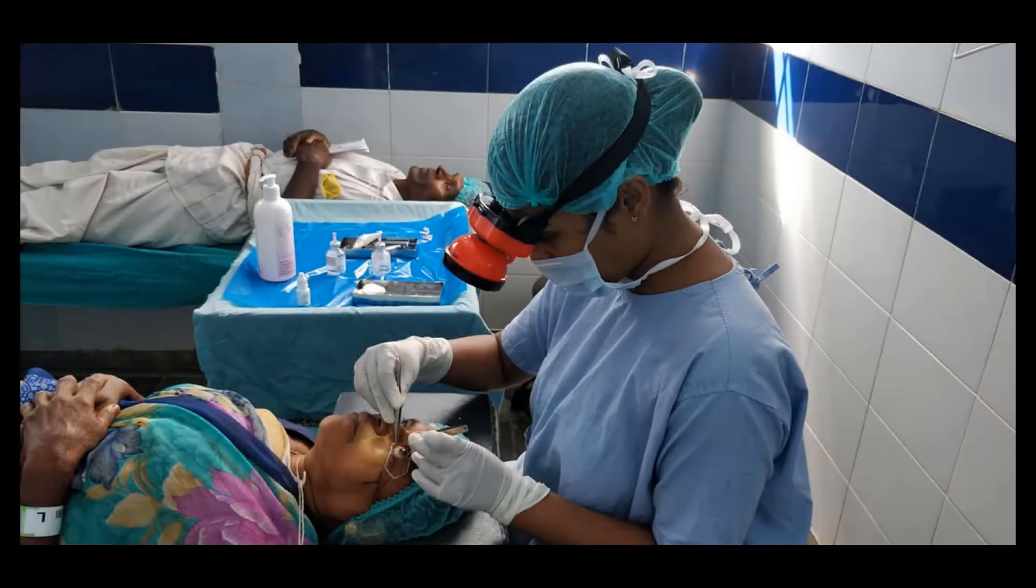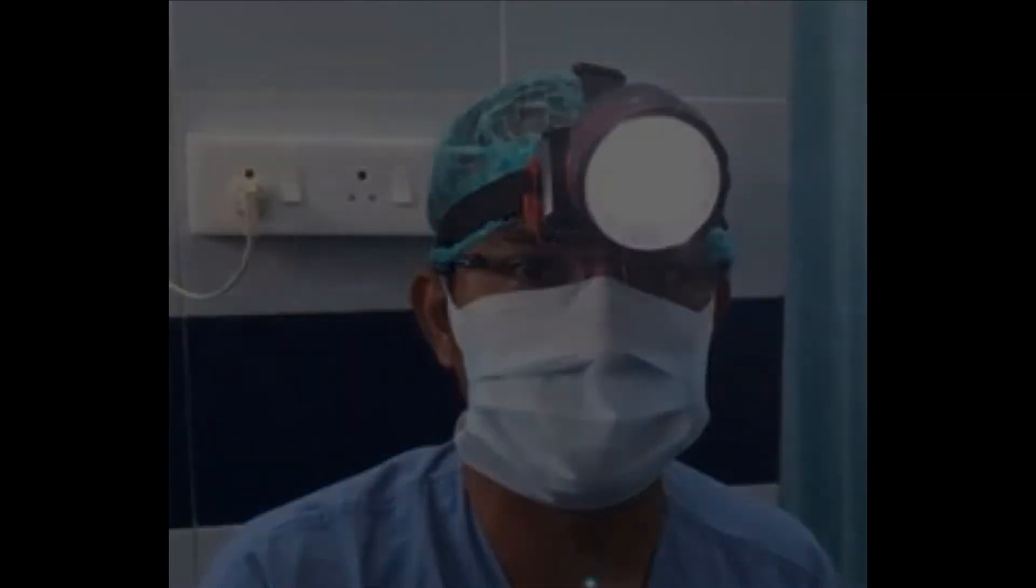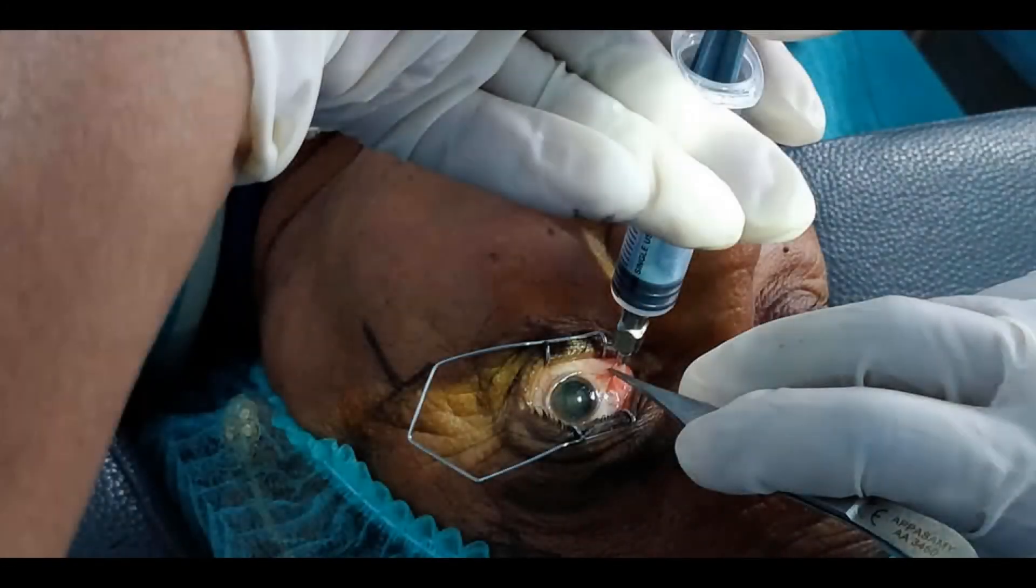Subtenon LED for performing the subtenon anesthesia where a clear view of block site is imperative. The device consists of a headband to be worn around the head by the doctor performing the anesthesia. It has a white LED light in center. This helps the doctor to see the patient's block site clearly.